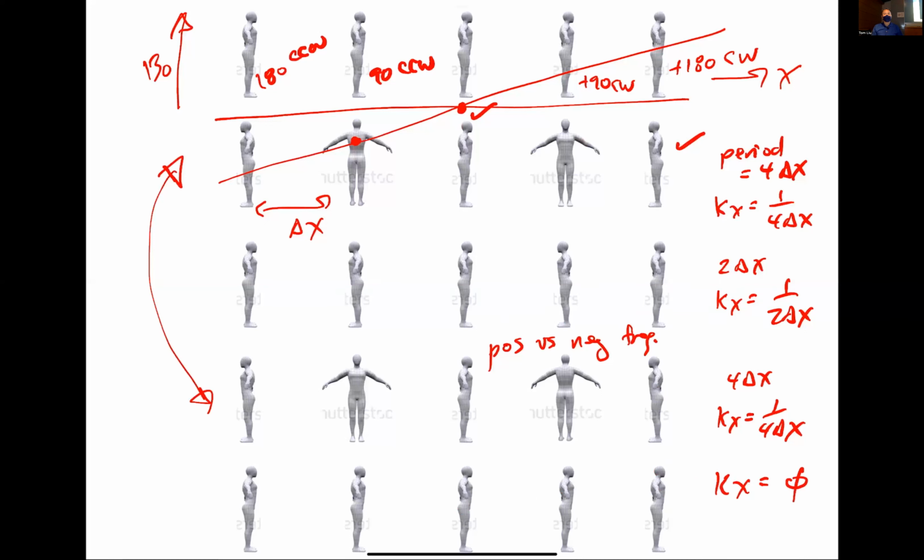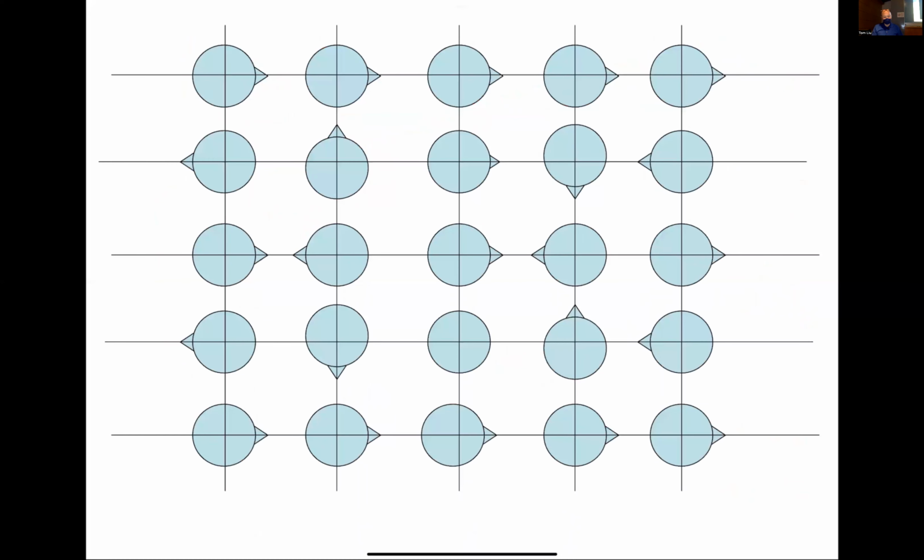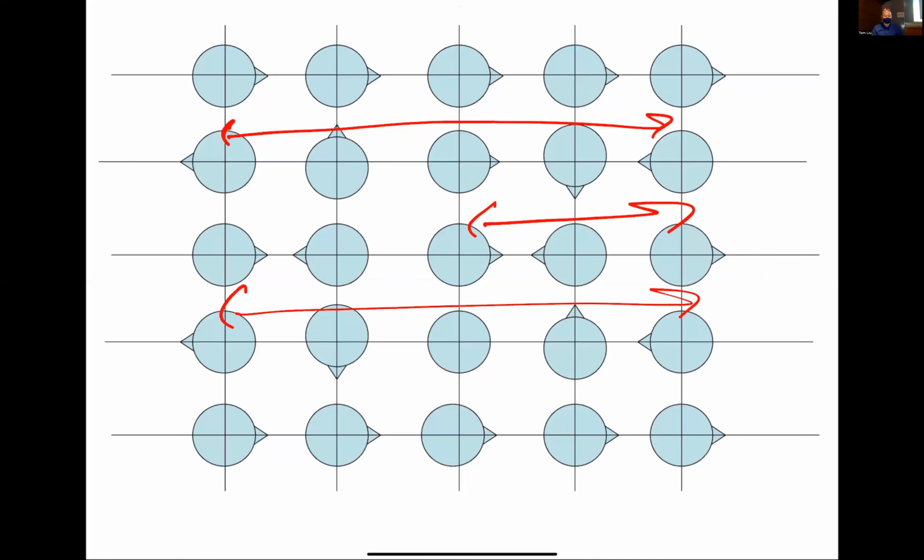Okay. So this is basically what we're doing with spins. As you can see, these are spins and we just play them out in the presence of a gradient. Now this is a very simplified example, but the point I want to get across is we were able to get different periods of spatial variation, right? And essentially these are going to turn out to be our Fourier basis functions. Okay. So this is just drawing that from a top plan view, same idea. You can see that this is this period, this period, this period.